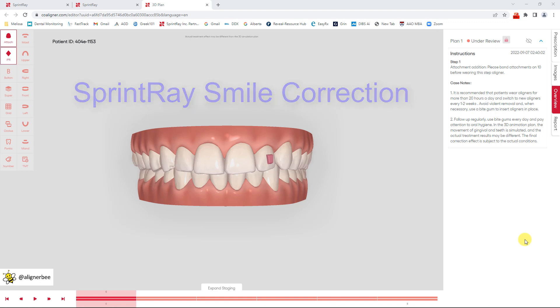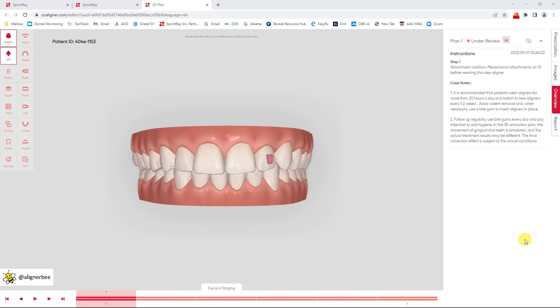I used the SprintRay Pro quite a bit in my orthodontic practice so I wanted to take a look at the setup and design service because this could be a big time saver in my in-office clear aligners workflow. I went ahead and submitted one of my patient's cases that only needed minor tooth correction and I've received my treatment setup back.